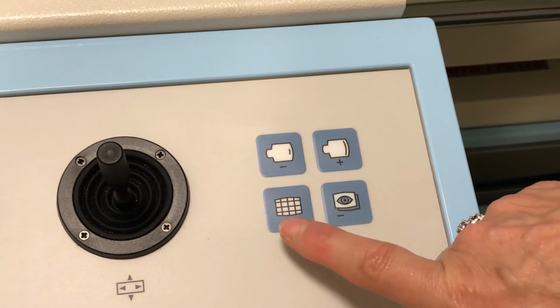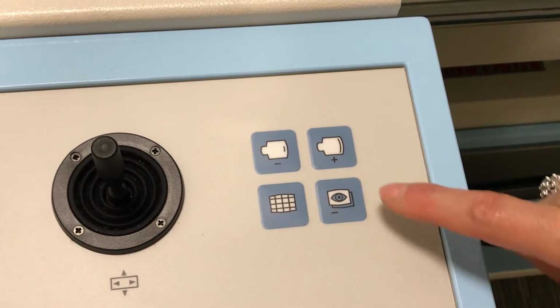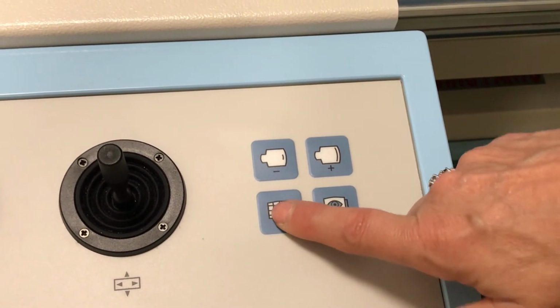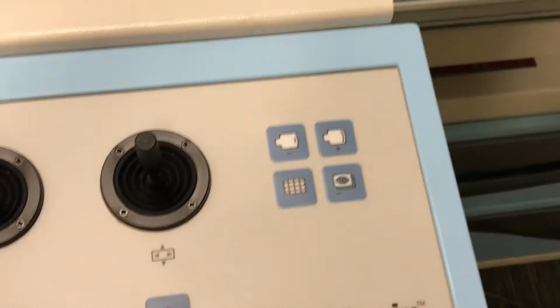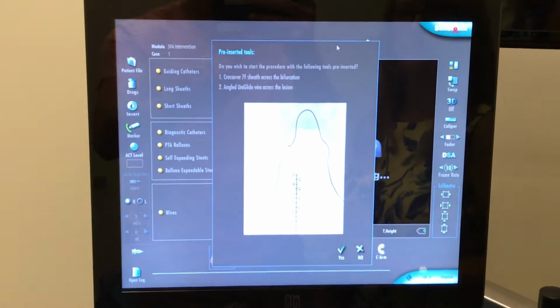This is going to be when you do any runs to bring up all of your image library that you can select. And how do you toggle through those? It's going to come up on this screen. And it's a touch screen, right? It's a touch screen. So you would select this to bring up all your runs, and then you would go up here and select them, and you could do a press on the screen.